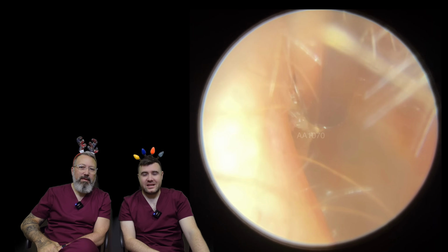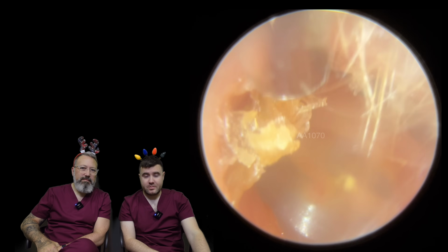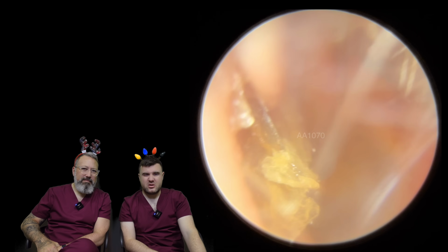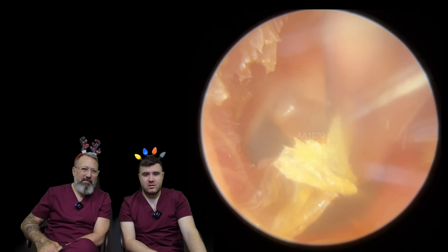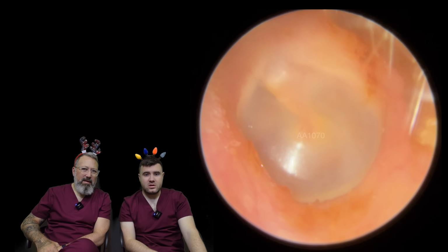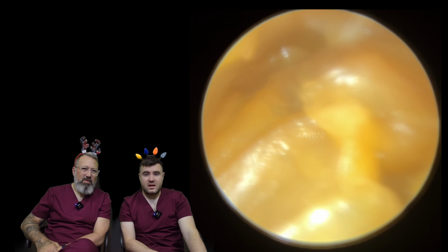Just a little bit of tidying up here now. Patient's hearing so much better already. Blockage is clear, but we've just got these little bits of dry skin that are just holding on. There we go. It's peeled away quite nicely. Eardrums looking nice and healthy. Perfect. And we've got pretty much the exact same on this side.